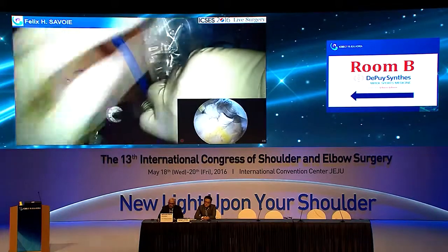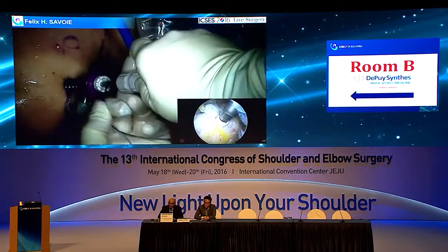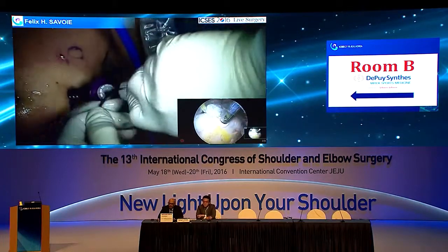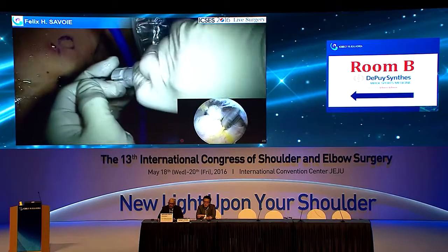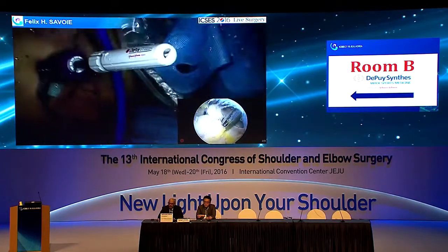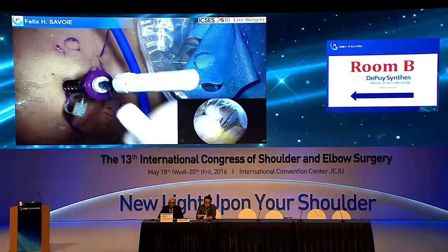How much tension is too much? Well, you know, Hawk did a study in Greenville about pulling it too tight. And so I think that I just barely pull it so that it cinches down a little bit. So it's a good bite. And then we'll come back in here.